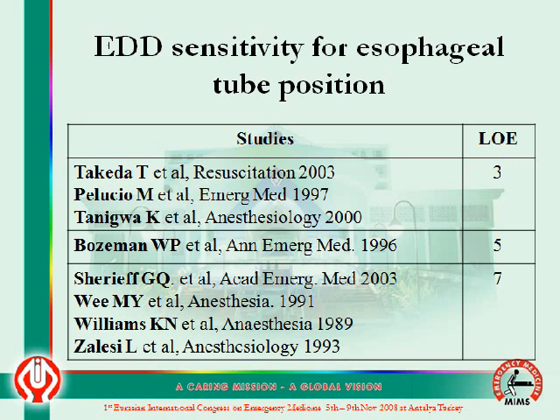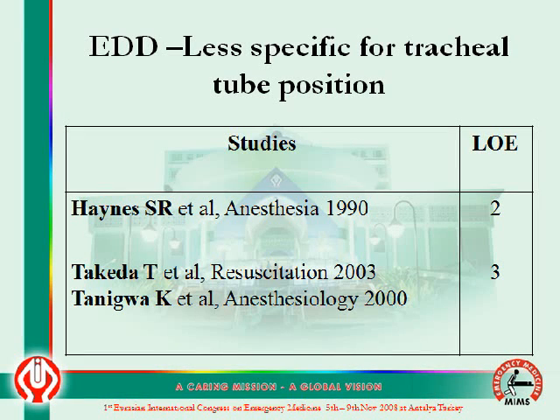The EDD sensitivity for esophageal tube positions is confirmed by different studies with a great level of evidence. The EDD is less specific as far as tracheal tube positions are concerned. We have evidence at the level of 2 and 3 to support this.